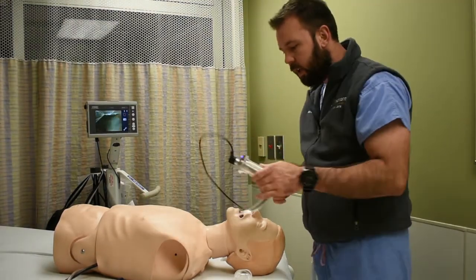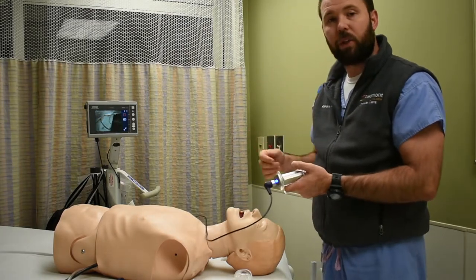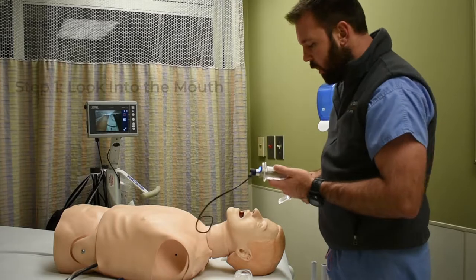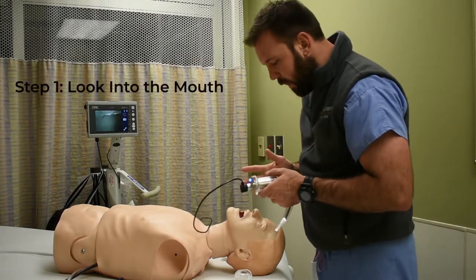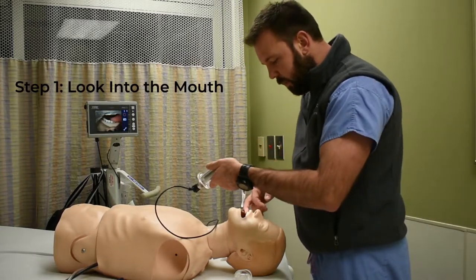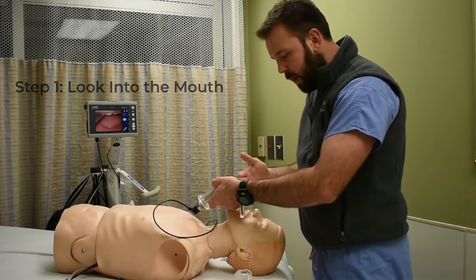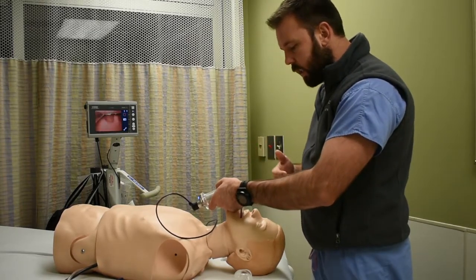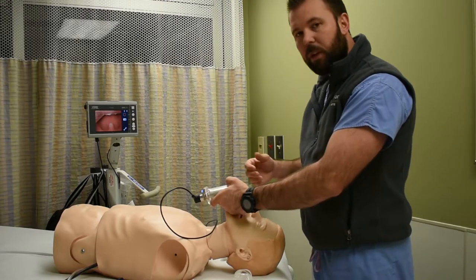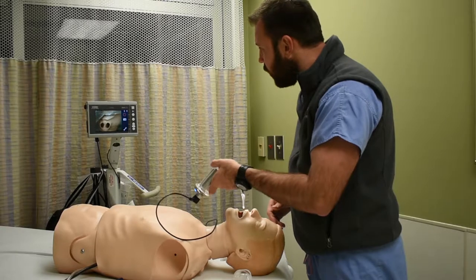To introduce VL, I want to talk about four discrete steps we should use every time we do a VL intubation. Step one: look into the mouth. We want to gracefully guide the tip of the laryngoscope blade into the mouth past the tongue without causing airway trauma or damage to the teeth. The pitfall here is trying to look at the screen too early before guiding it past the tongue.